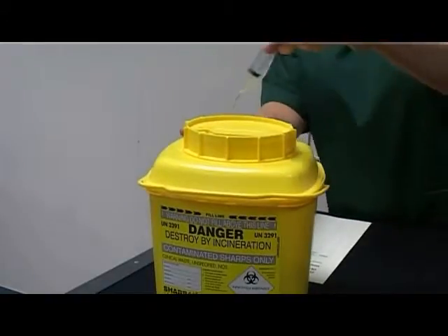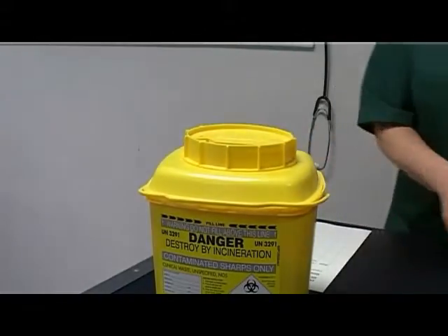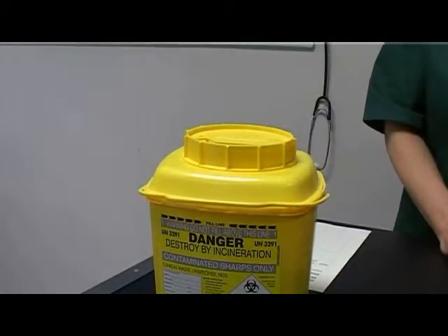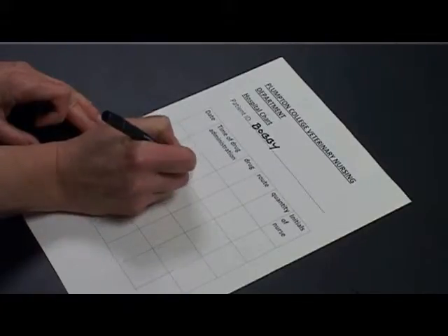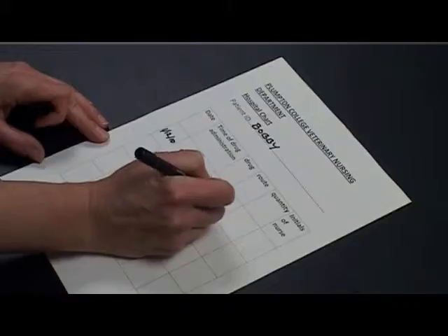Withdraw the needle from the patient and massage the injection site gently. Dispose of the used needle in the medicinal sharps bin without resheathing. Dispose of the syringe in an appropriate container. Record administration of medication fully on a hospital chart, including date, time, drug given, route of administration, quantity of drug and initials.